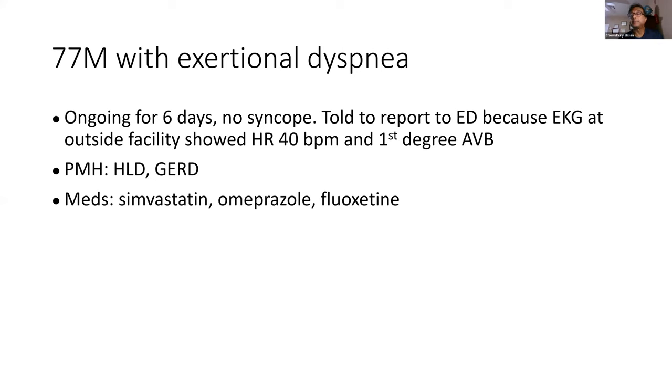Atharva, do you have any comment? So you have gone for CRT-D. Yeah, just to let you know, to avoid confusion, this is how you communicate. We usually call it BIV paced, and we reserve the term CRT for when we are giving an ICD. But you and I mean the same thing. For the audience, we pace BIV, but there is no ICD, so the cost may be a little cheaper. So CRT-P, sir, CRT pace maybe. Correct, correct.